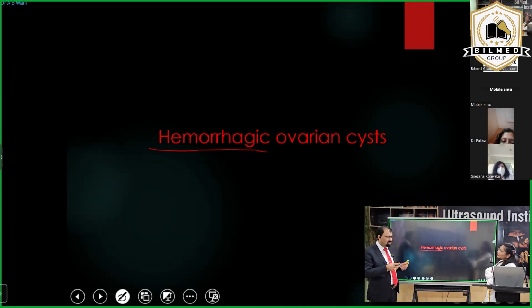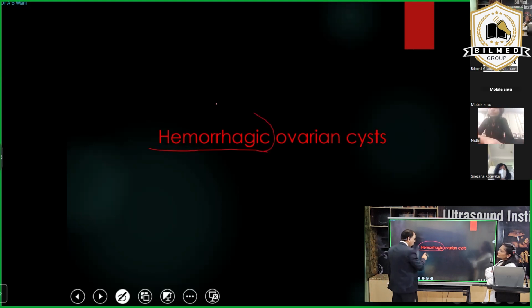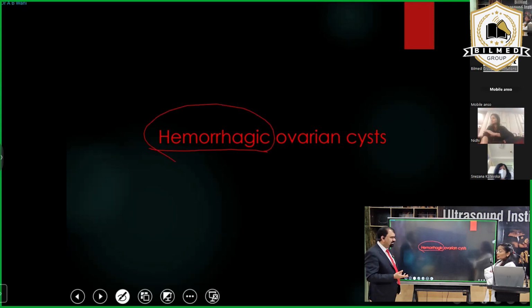No, big no, because this is not live blood but a dead blood clot, and your color Doppler is not picking up dead blood, but the flow in the vessels, the live blood. Don't expect a hemorrhagic cyst to take color, and if it takes color, then it is not a hemorrhagic cyst at all.